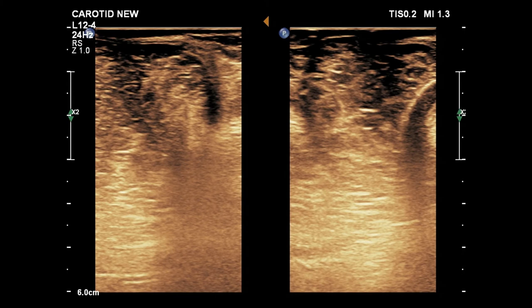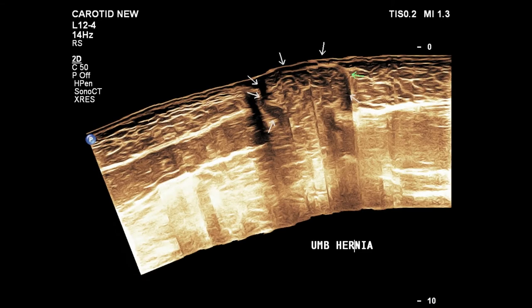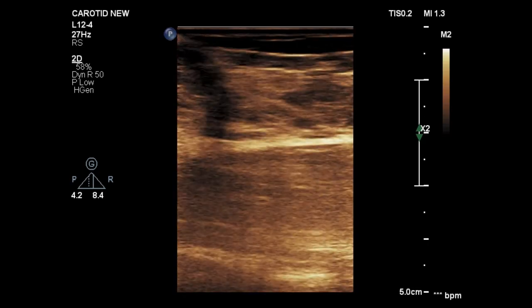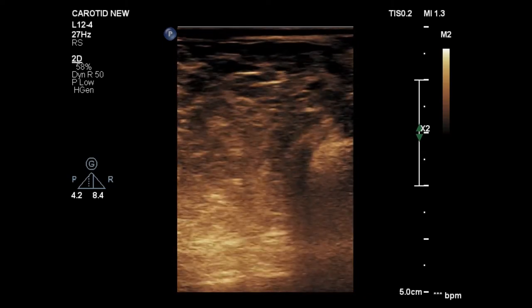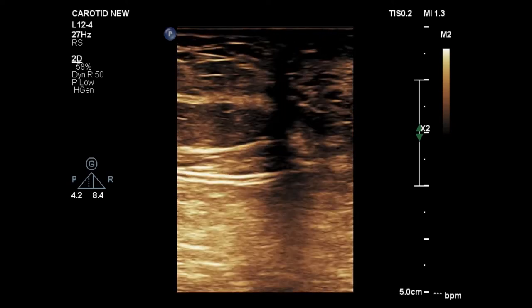Again, you can see the herniated contents coming from the abdominal cavity to the superficial region. This is a panoramic view showing the umbilical hernia of this patient. This area represents the umbilical hernia. Now let's see this case in real time. While scanning the superficial region, there is a herniated content — we can see it at the subcutaneous layer coming out of the abdominal cavity.